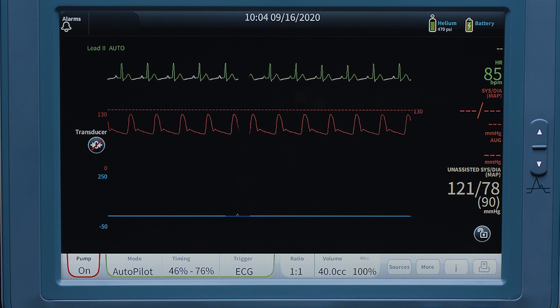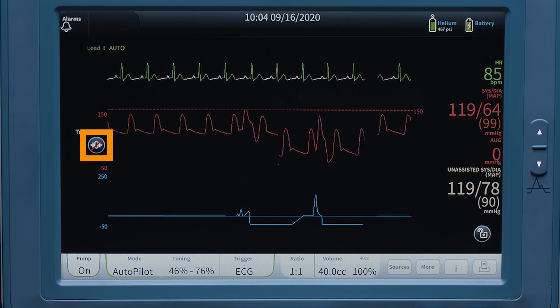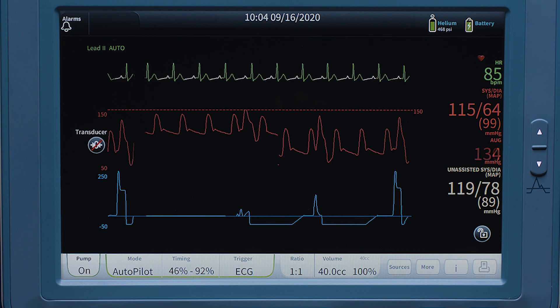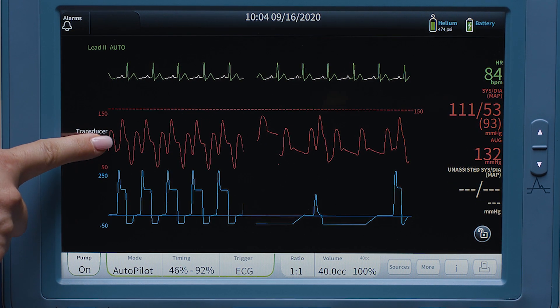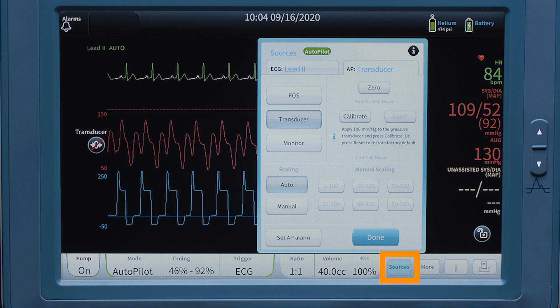However, this can be completed after therapy has been initiated on the patient. The zero icon with a red line through it indicates that the transducer has not been zeroed. To zero the AP transducer, touch the zero icon on the screen, the AP waveform, or source key.